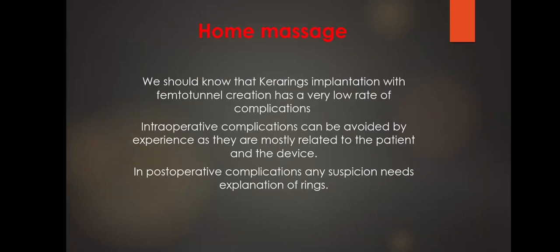Take-home message from this presentation: we should know that Kera rings implantation with femtotunnel creation has a very low rate of complications. However, intraoperative complications can be avoided by experience, as they are mostly related to the patient and to the device. In postoperative complications, any suspicion needs explantation of the ring.